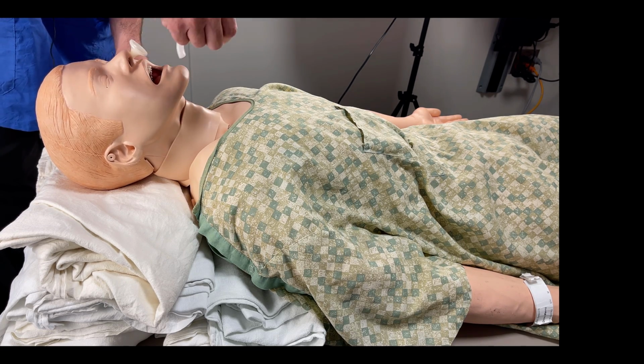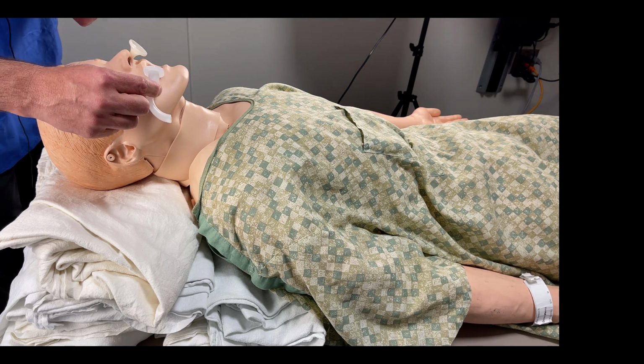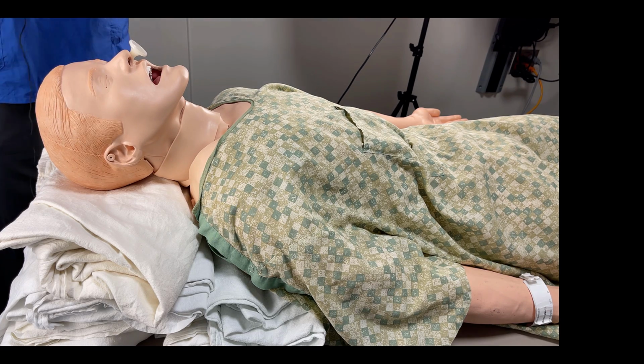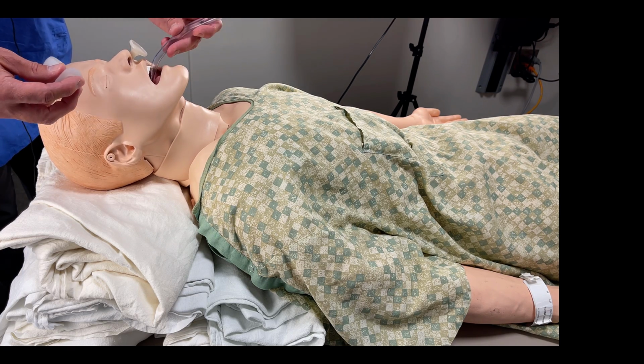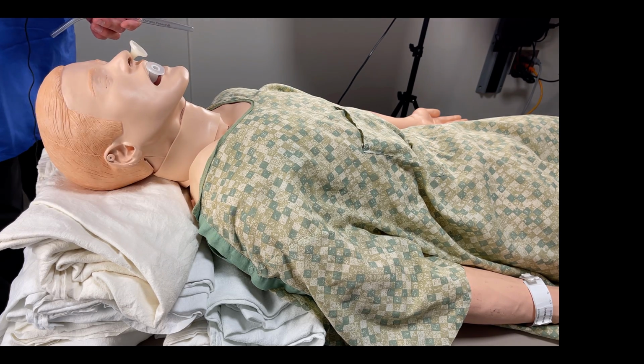Now again, just make sure that when you use your oropharyngeal airway, you're sizing it for each patient. It should be from the corner of the mouth to about the angle of the jaw for the patient. If it's improperly seated, it actually can become detrimental, as it can worsen obstructions and make it more difficult to ventilate your patient. So again, having something like a tongue blade or suction catheter, I can just slide this in real easily. That's it.